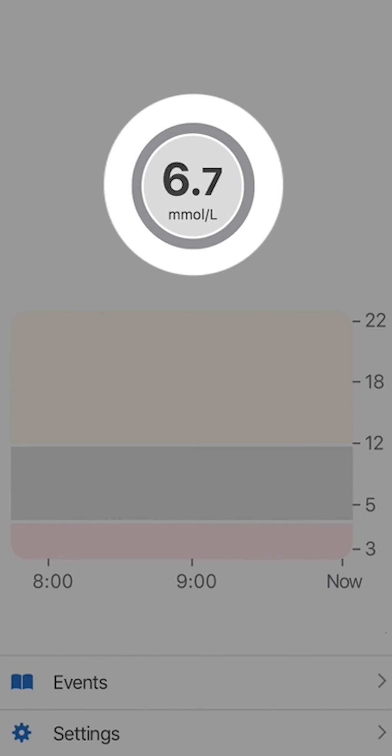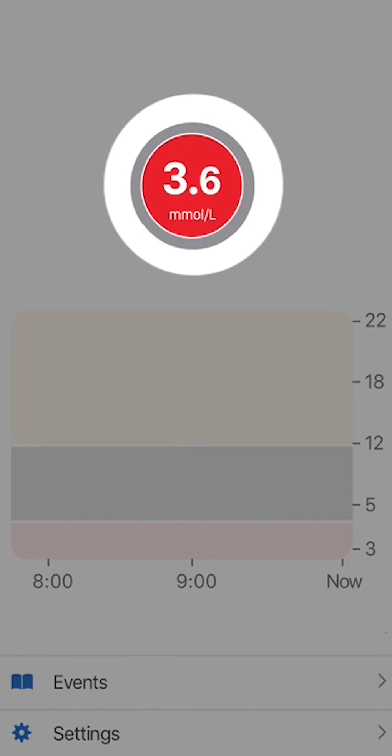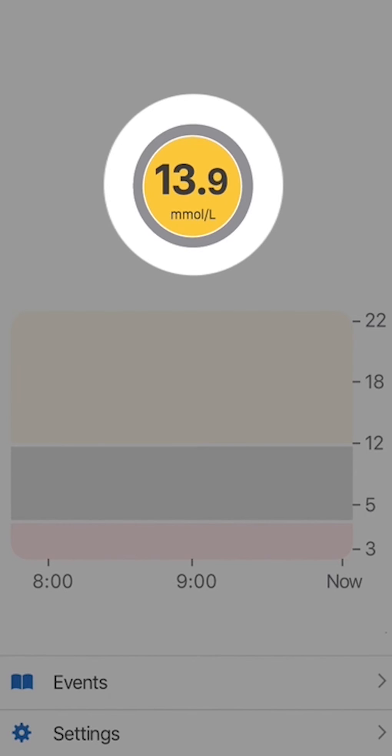The colors let you know where you are at a glance. Grey? Good. You are in your target range. Red? You are low. Yellow? You are high.